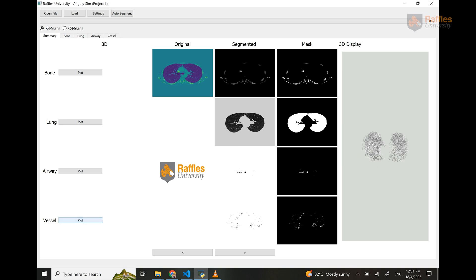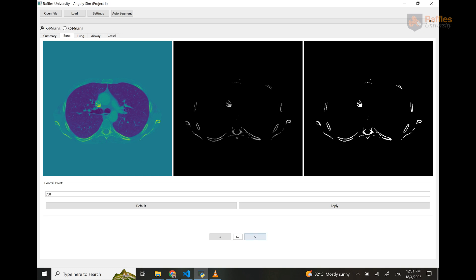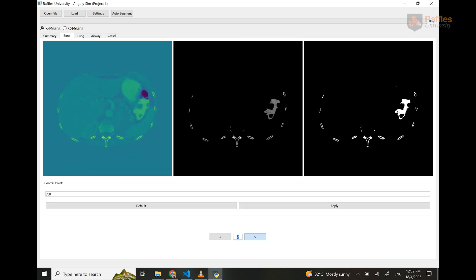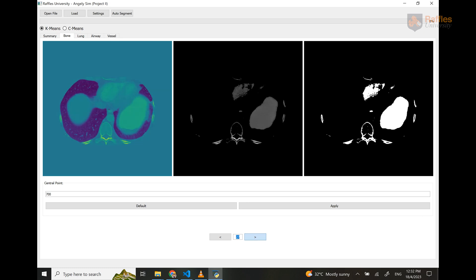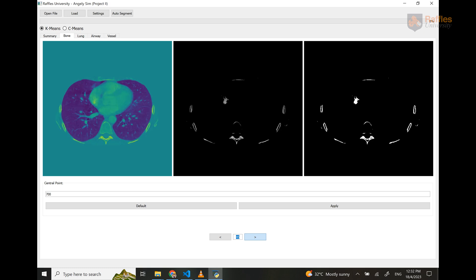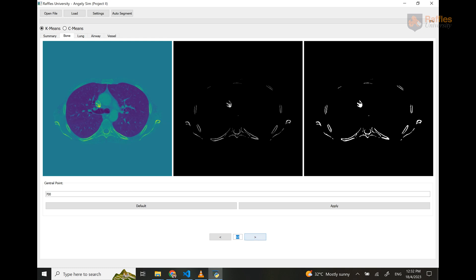If the users want a closer look at each of these parts, they can go to the respective tab. The first tab is the bone, and users are allowed to make changes to the central point as they like. If I click Apply, the mask will be automatically updated. And if they want to revert to the default value, they can just click the Default button. This function works the same for every other tissue and organ.